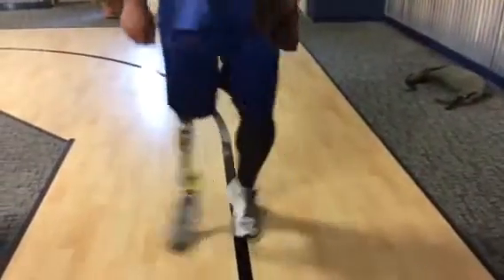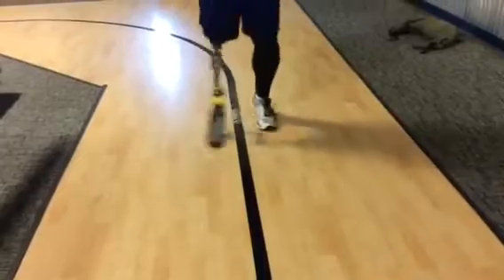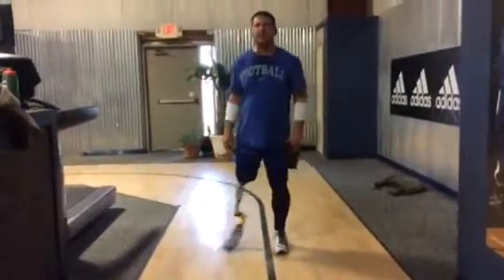When you start to move forward, do the same thing. Back and forth. And then slowly just kind of start walking forward. You do the same thing backwards. And that's something you can build up more and more. At first it will be really hard, but slowly over time you'll be able to start building up stamina. So you can build up speed.